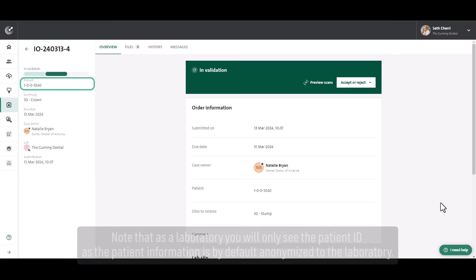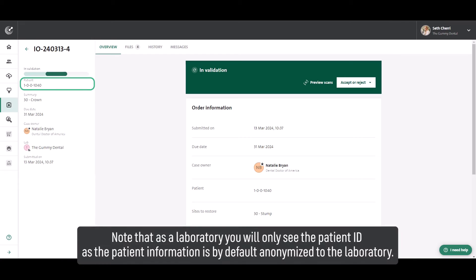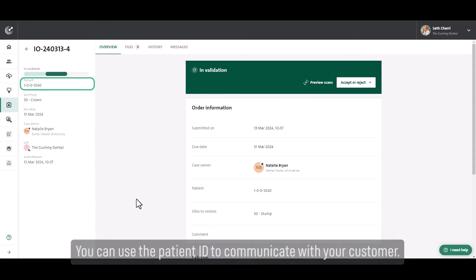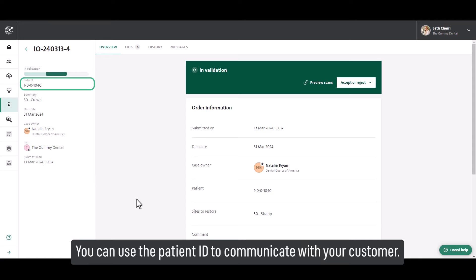Note that as a laboratory you will only see the patient ID as the patient information is by default anonymized to the laboratory. You can use the patient ID to communicate with your customer.